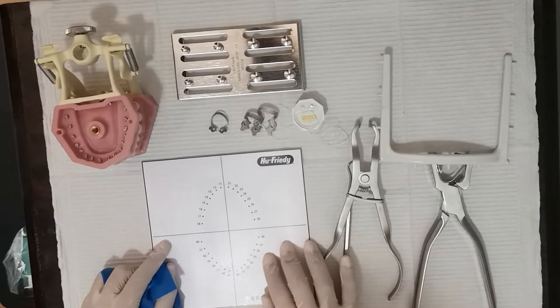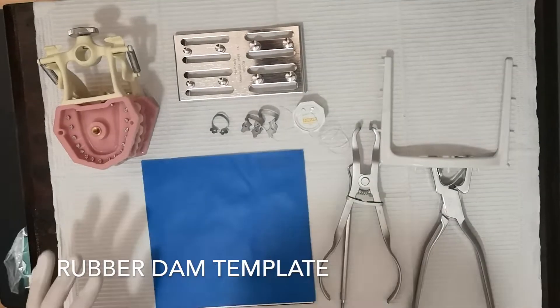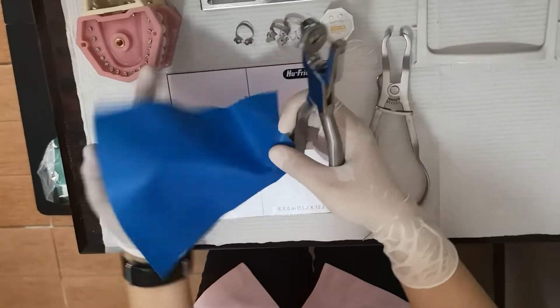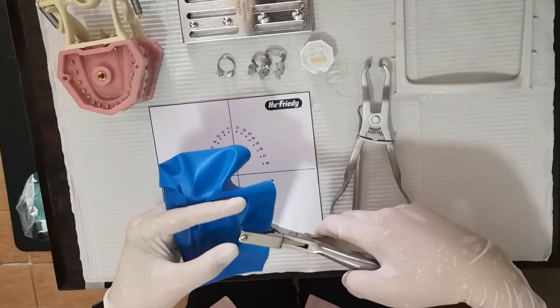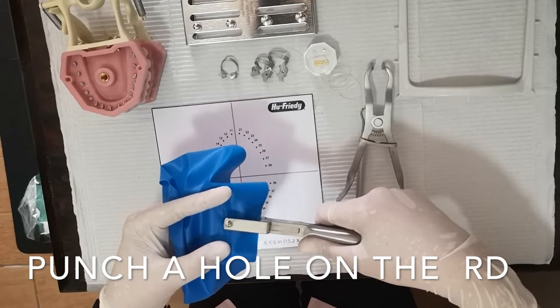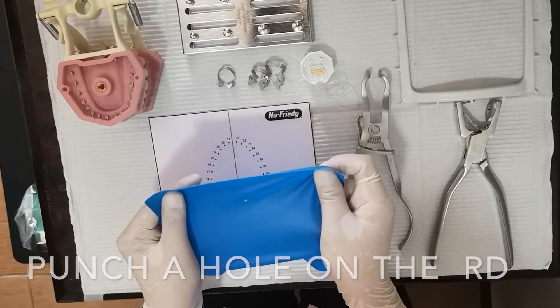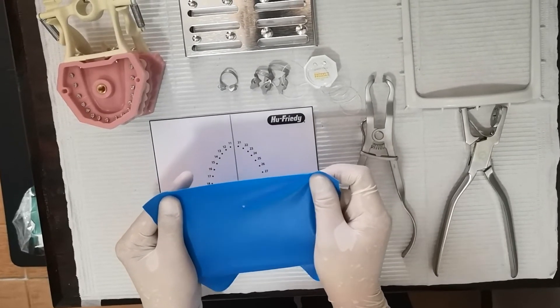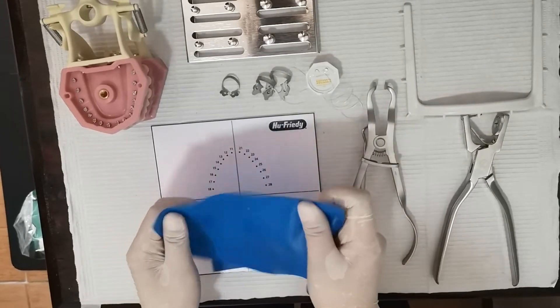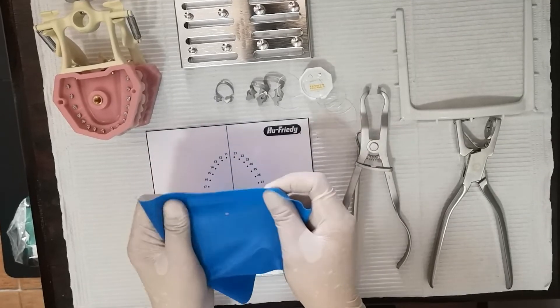I'm going to isolate this tooth. Put the rubber dam punch here and make a mark. Insert and then pull it up and down. Make sure that the hole is clean — there are no nicks or tags. Because once you stretch the rubber dam sheet, those nicks and tags will cause tearing.